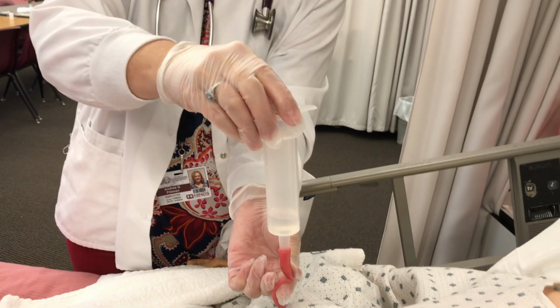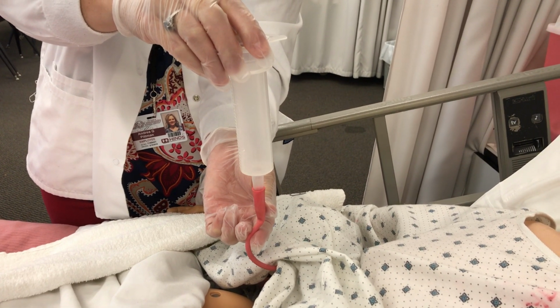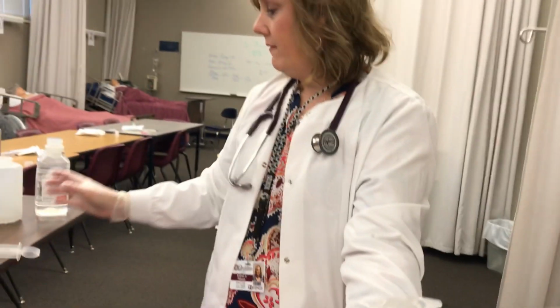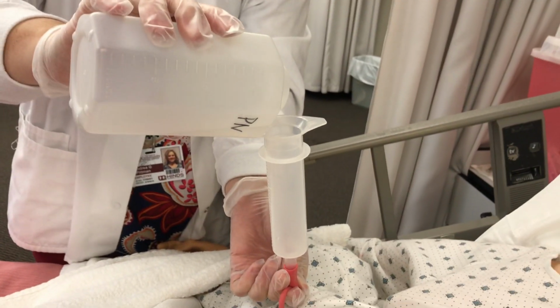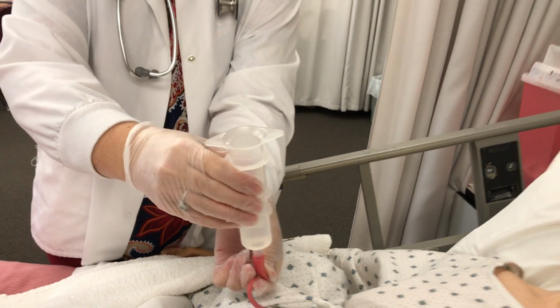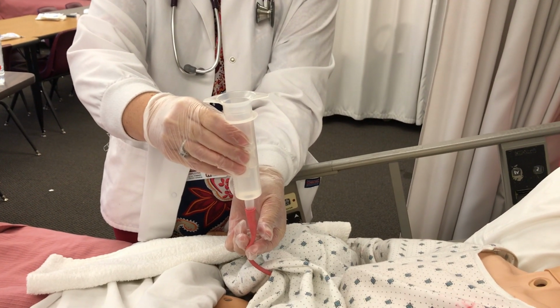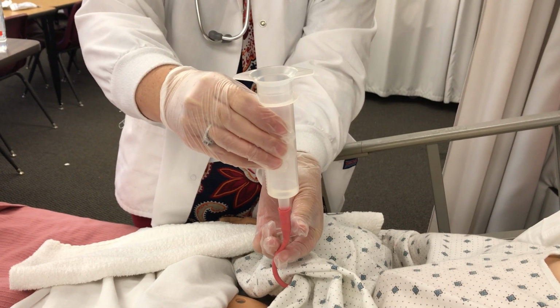Okay, so I'm going to let the stomach contents go back in to gravity. And right before the stomach contents gets to the end, I'm going to clamp it off again because we don't want any extra air. So everything's ready for us to do our feeding. So I'll take the 50 cc's of flush before the feeding. And since my order says to flush with 50 before the feeding and 50 after the feeding, that's exactly what I'll use.